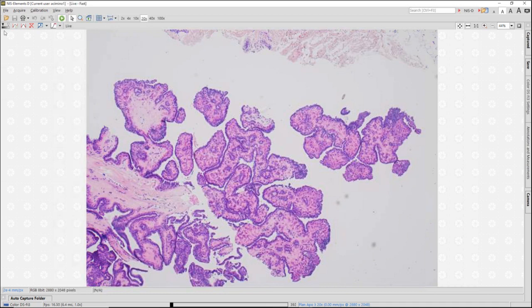Again, this is to contrast what we'll see later with encapsulated papillary carcinoma. So benign intraductal papillomas tend to look very pink from low power, have sclerotic hyalinized cores, and tend to have very broad-based, larger branching papillae, rather than delicate, thin cores.